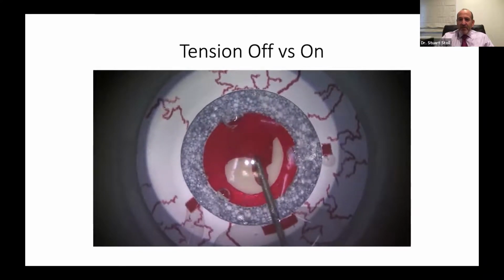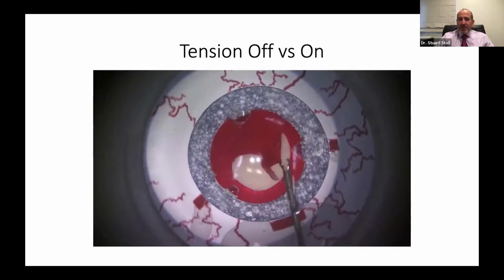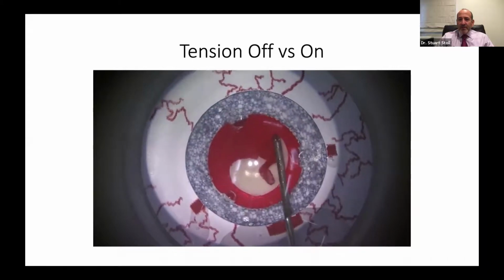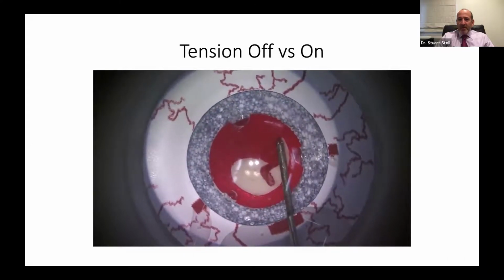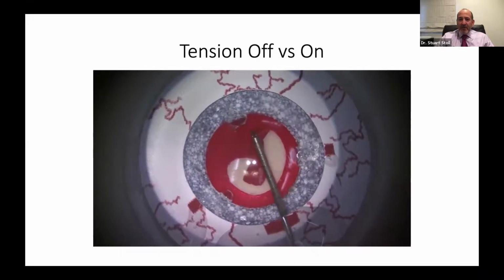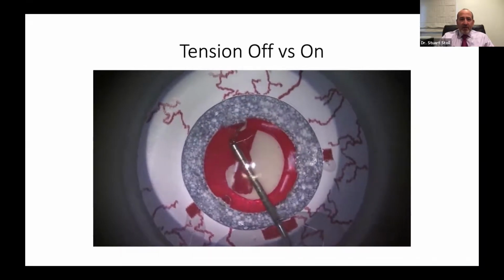Now we're going to reposition. We're around that 2 o'clock position. It's easy to re-grasp, not too close, right about there. Tips down towards the point of propagation, and now I have movement. I can move that capsule without tearing anything. And here we go around a little bit more.